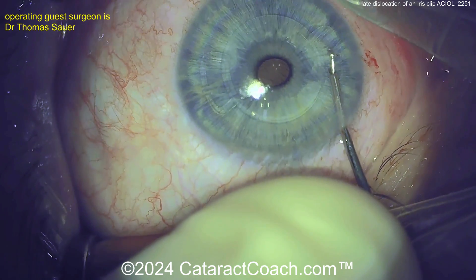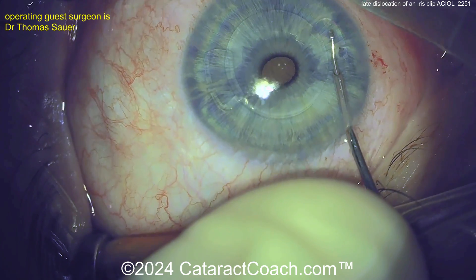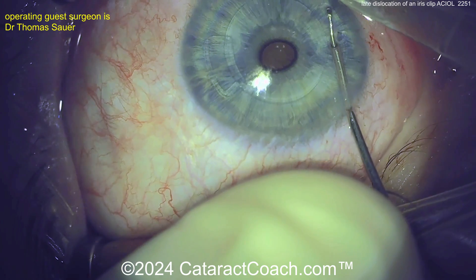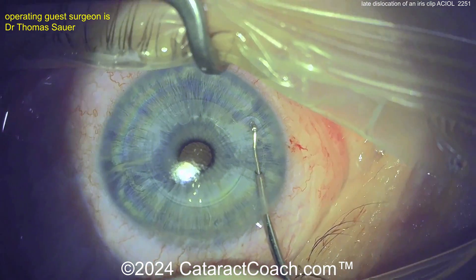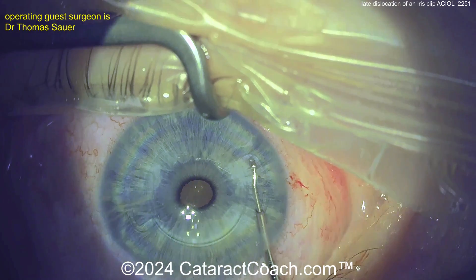If you didn't have this spreader, I'd just stabilize the optic with my left hand — maybe put a spatula on top of the optic — and then use the enclavation tool to grab a good knuckle of iris and bring it up through the claw. But I do like the spreader technique. I don't think I have one of these on my surgical trays — I'll have to look into it.